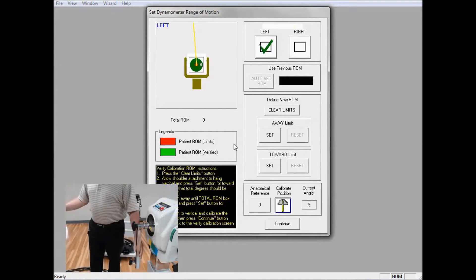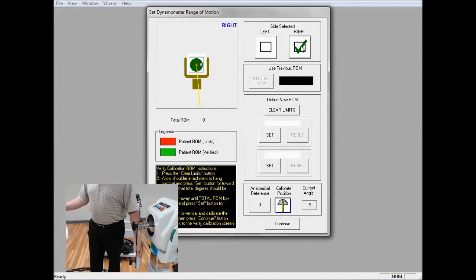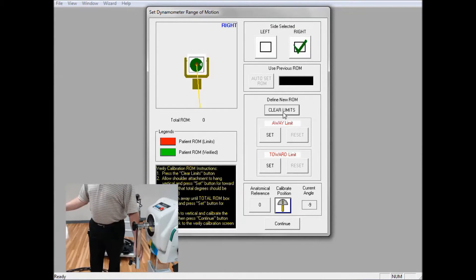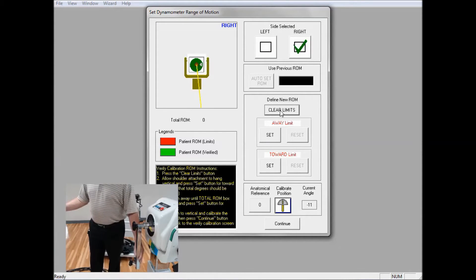Choose the correct side. I'm going to be using the right side. I'm going to Clear Limits. I'm going to hang the attachment vertically and I'm going to click on Toward.